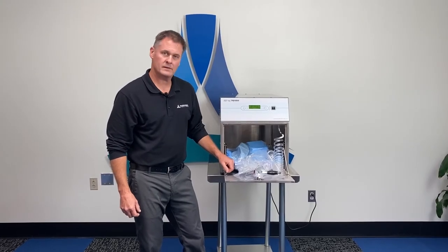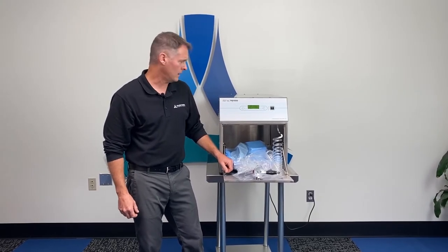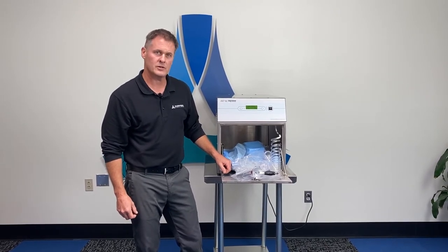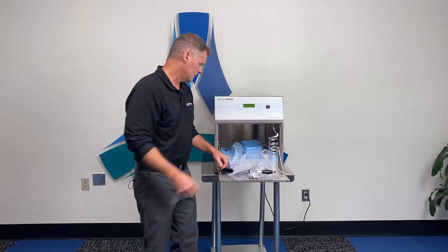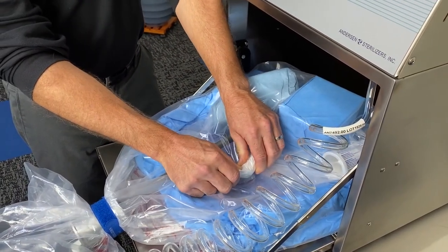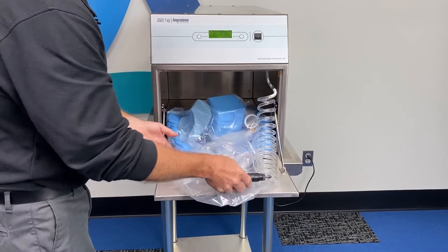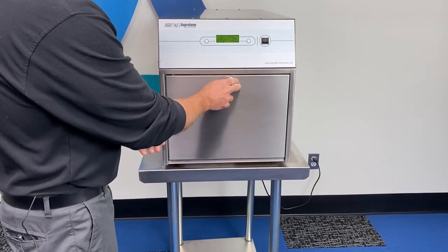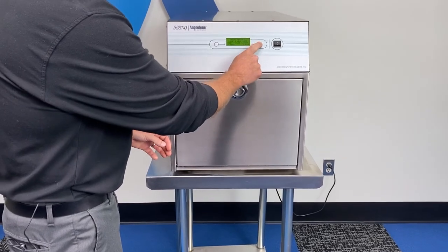At this point, the sterilizer has completely purged the liner bag and will instruct you to break the ampule, close and lock the door, and choose a cycle. You'll break the ampule through the outside of the bag, then close the door and choose a cycle.